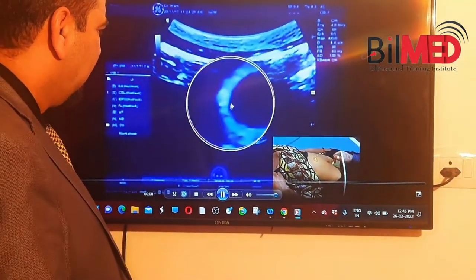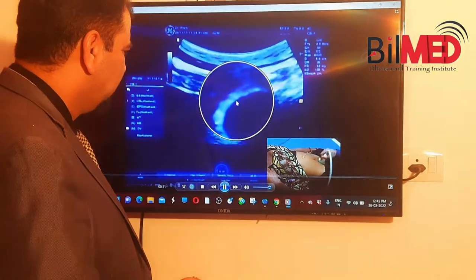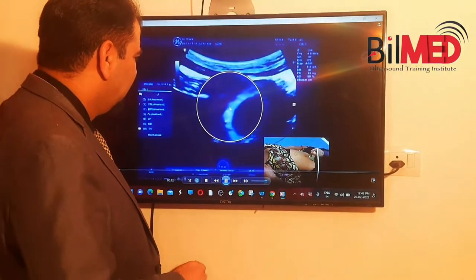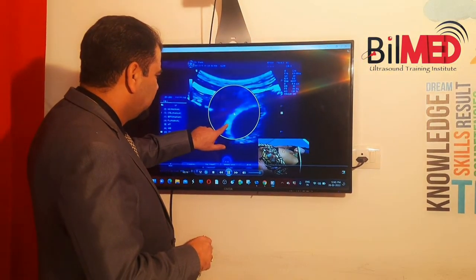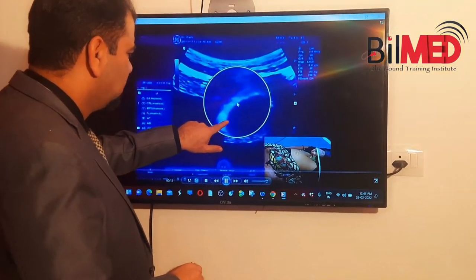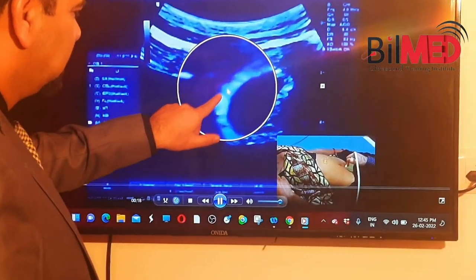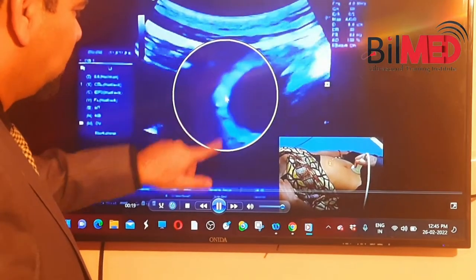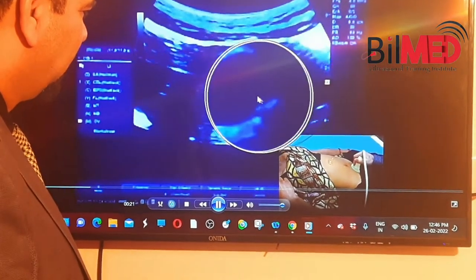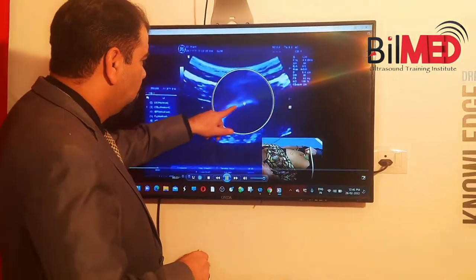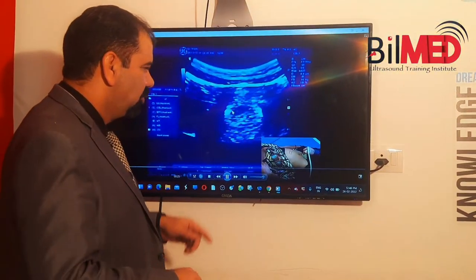This is the gestational sac which you will pick on the ultrasound machine. The point here is that there are decidual reactions. See this — this is the decidual reaction which is more hyperechoic over here. The point is this decidual reaction will not be uniform throughout.